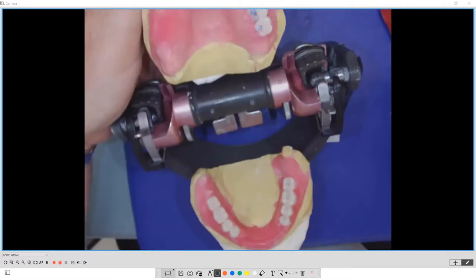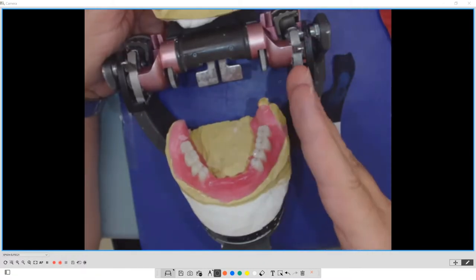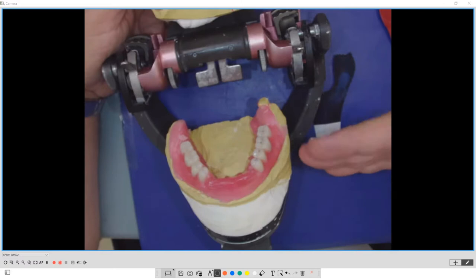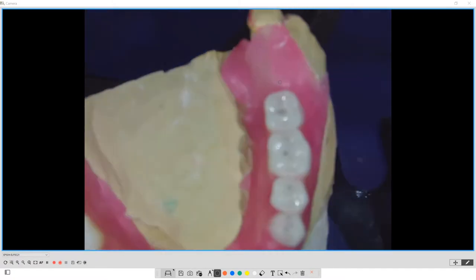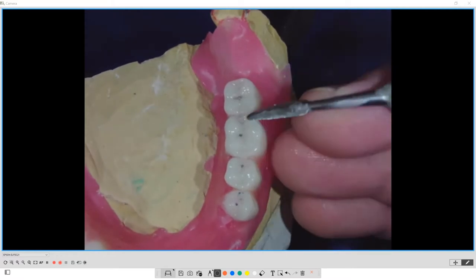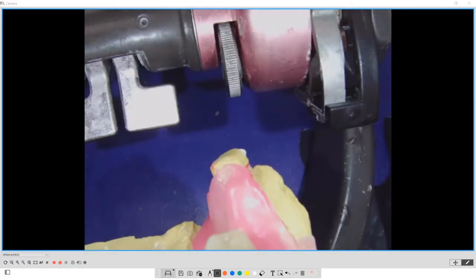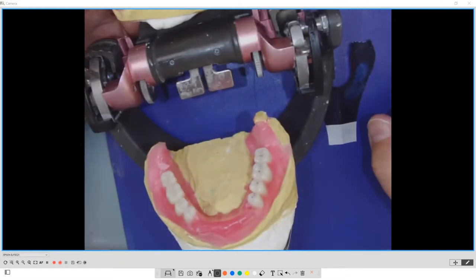And now I can find that in the mouth without introducing an outside stimulus by altering the position of the tongue or the cheek by using the retractors or the calipers or whatnot. I'm letting the patient give me unaltered, unfiltered feedback about their system. And that's how you can check it in the mouth, whether it's an implant case or a denture case or such. And that's how you can check for the marks without adding that outside external stimulus.